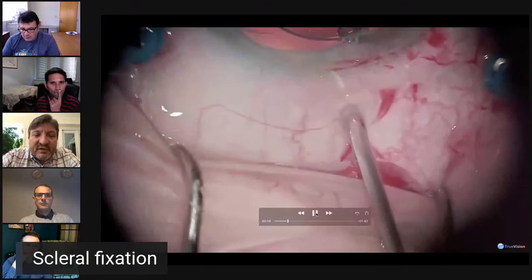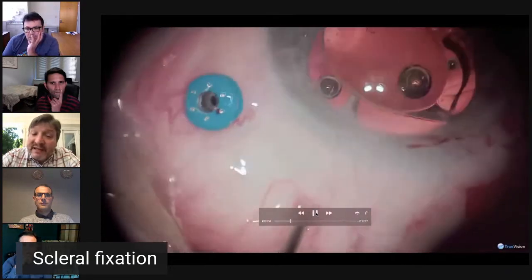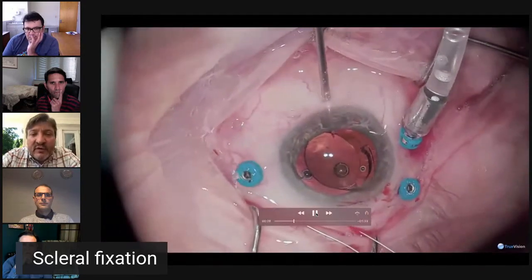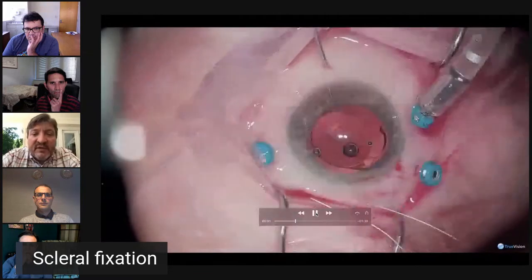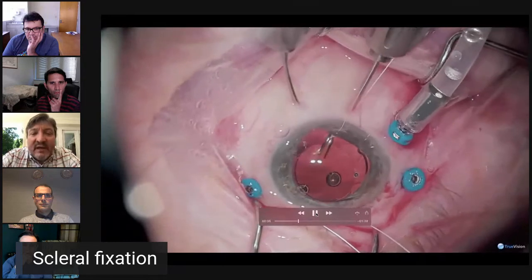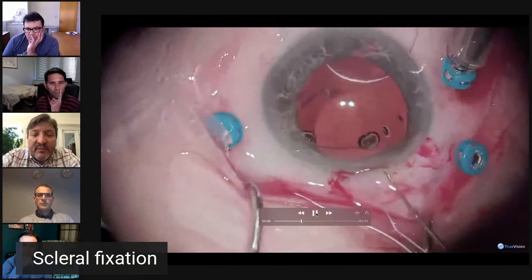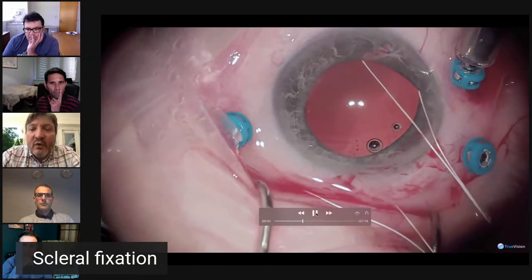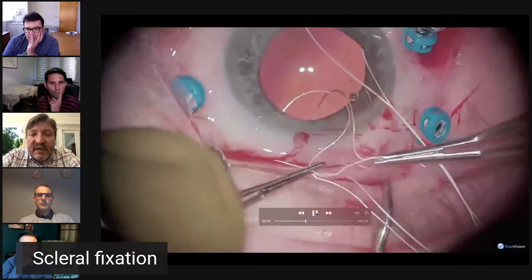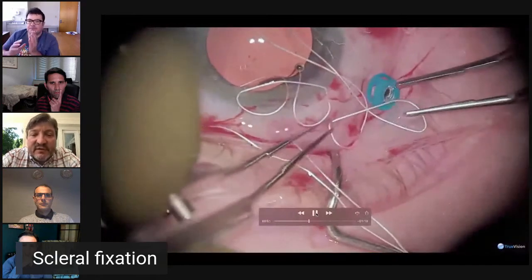This is a patient status post retinal detachment repair. And I'm making two sclerotomies transconjunctivally in the iris plane. And I hand a loop of Gore-Tex from one forceps to the other. These are MST forceps, into one sclerotomy and out the other, leaving these two loops of Gore-Tex dangling in the anterior chamber. And we turn the infusion down. We take the IOL out. We externalize both Gore-Tex suture loops, making sure that they don't get twisted or tangled. The orientation of the sutures here is really important.